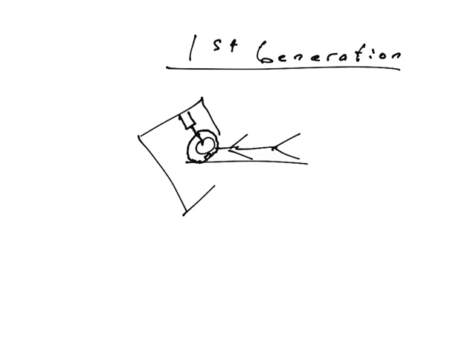And so the way this machine would work is the X-ray generator and detector are on this track. Okay. And so they can translate, they could slide over to the left. And in doing so, it'll sweep through the slice in the person's head, let's say. X-rays going through, goes all the way around.